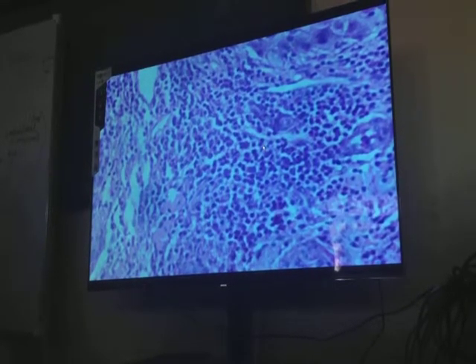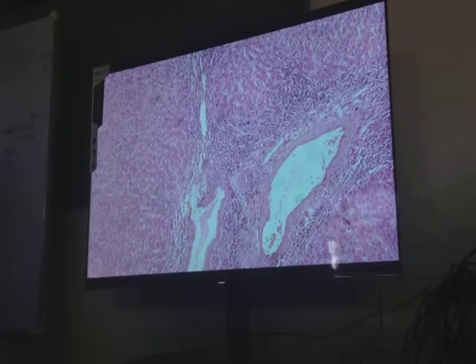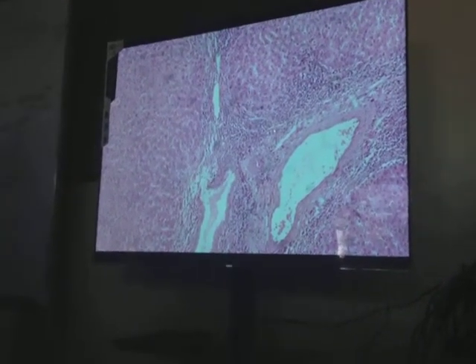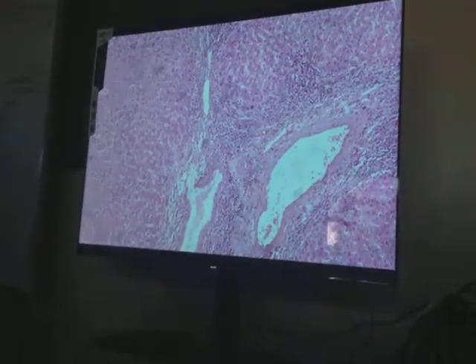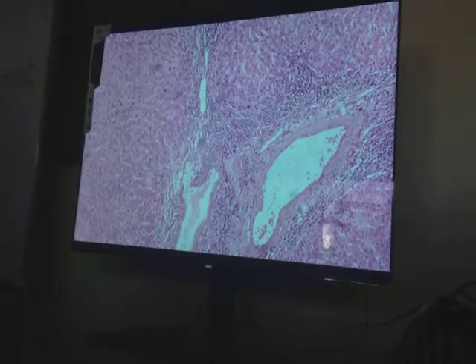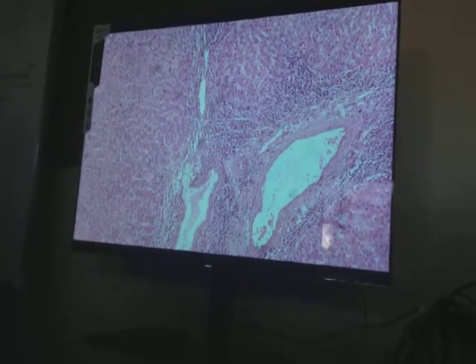So what is the exact name of the abnormality that we have identified? Hepatitis usually develops first in the portal areas. So this should be diagnosed as chronic hepatitis, based on the abnormalities that we have identified. However, this slide is labeled as primary biliary cirrhosis. So again, we must look for a bile duct.